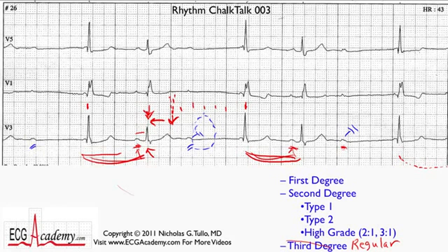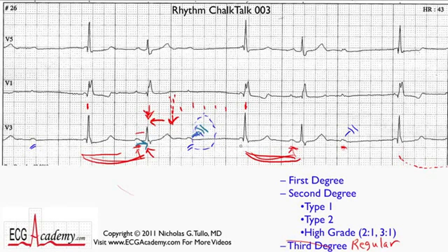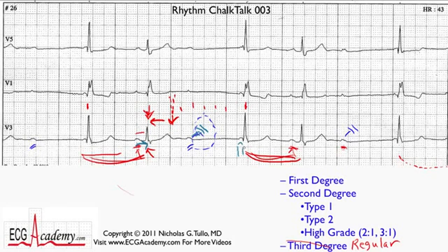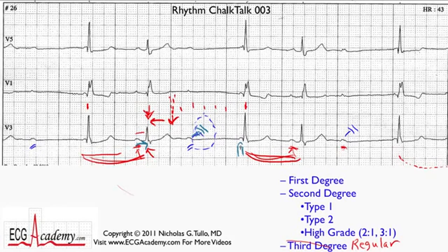It is the same patient after all. So this PR interval conducts, and then this P wave blocks. The question is, what happens here? It does look like there's a P wave, but the PR interval is extremely short — much shorter than you would expect if this P were to conduct. PR intervals generally can't get to be that short because the AV node is supposed to delay the signal a certain period of time. So it's unlikely this P wave conducted to this QRS complex.